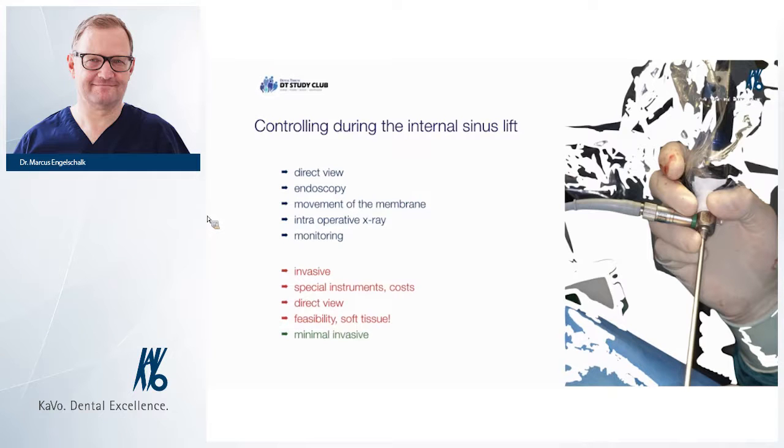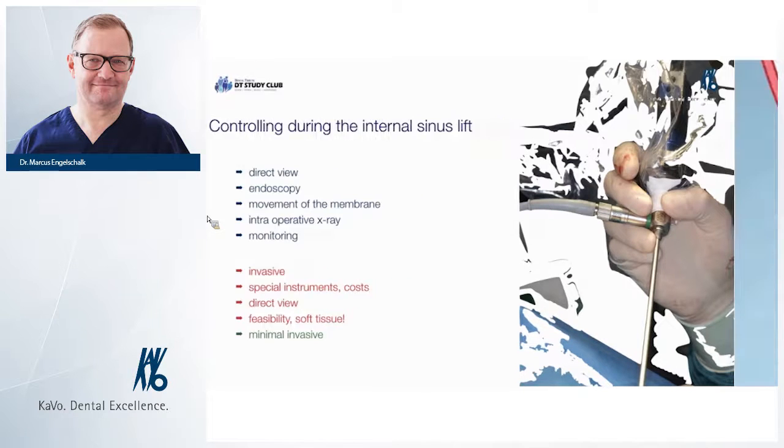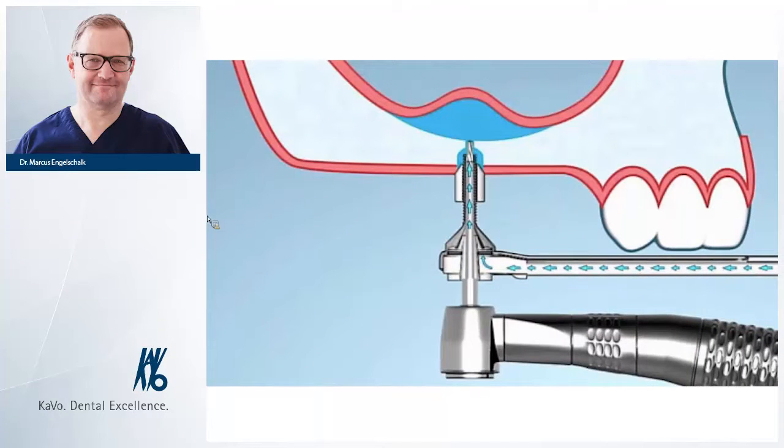You can exhaust it, and then you can see if it is the same amount of solution I used to go into the sinus, the same amount, and then you can calculate that it works very well. This is the first intraoperative feedback system. It's a very easy system, but now you can see, well, it's the same amount of liquid I had before and afterwards, so there should be no perforation.